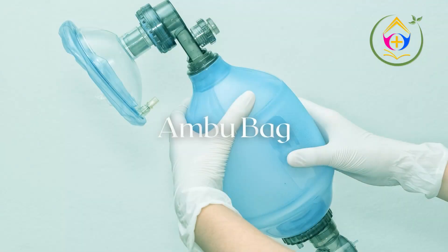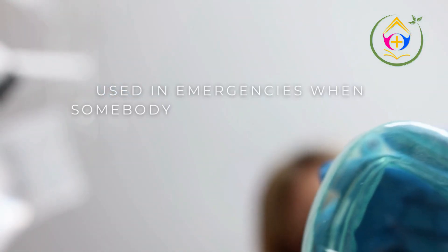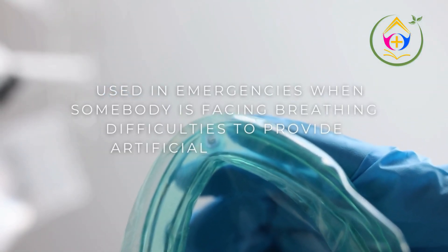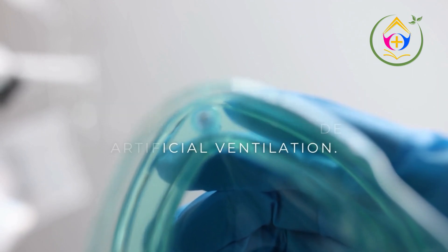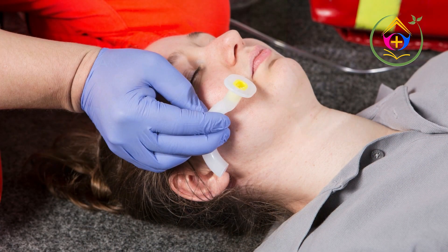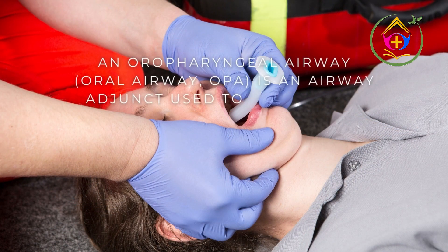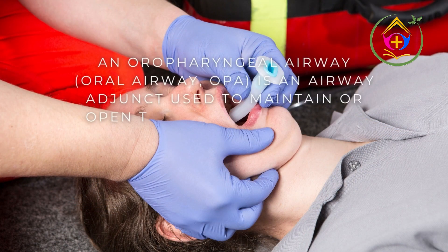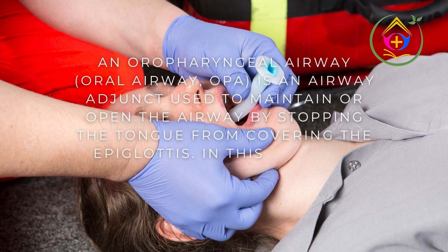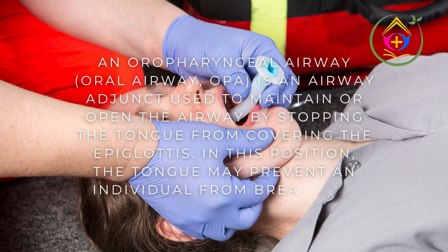Ambu Bag: used in emergencies when somebody is facing breathing difficulties, to provide artificial ventilation. Oropharyngeal Airway (oral airway / OPA): an airway adjunct used to maintain or open the airway by stopping the tongue from covering the epiglottis. In this position, the tongue may prevent an individual from breathing.